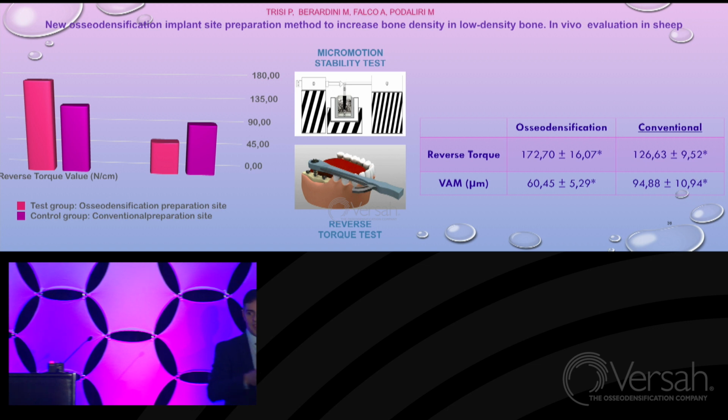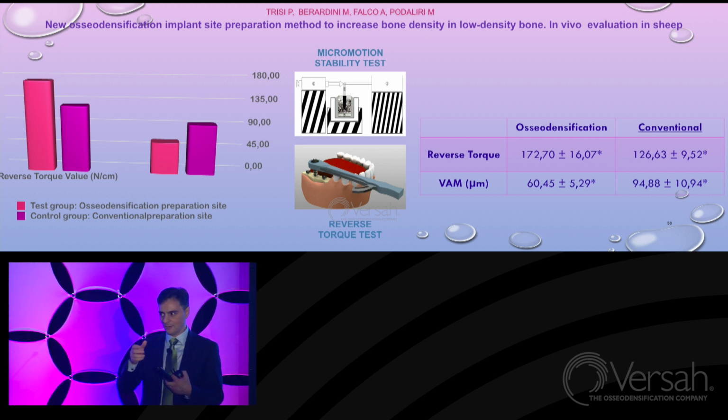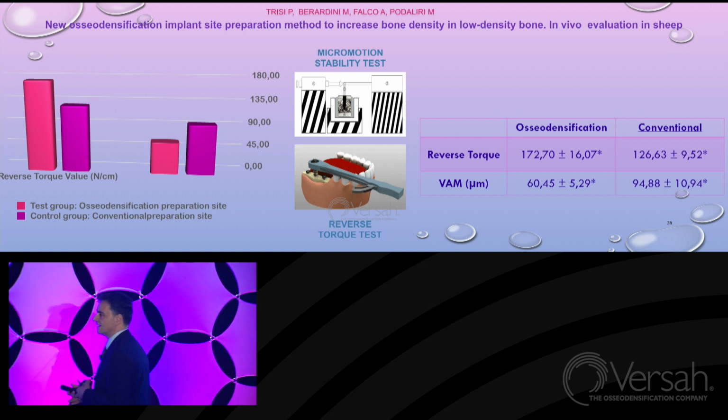This can explain your results clinically, where you see a change in the ISQ value during the early healing period. The implant is not losing stability, it's increasing stability with time, which is different from what we know from the standard healing process.